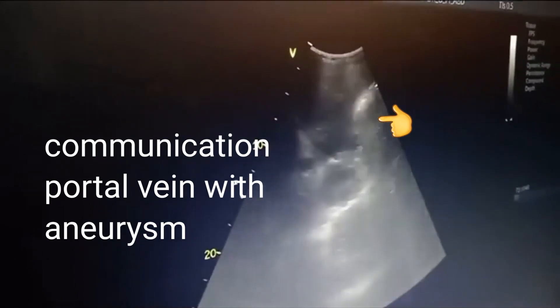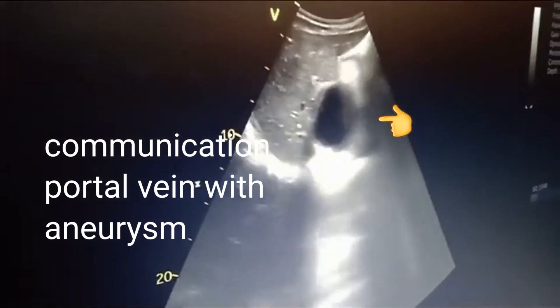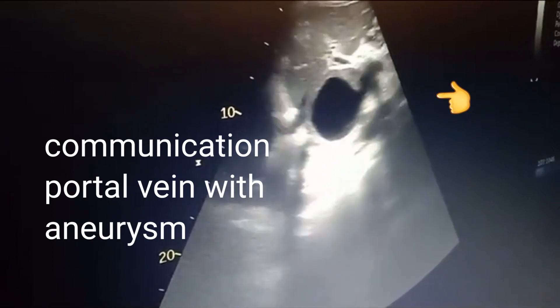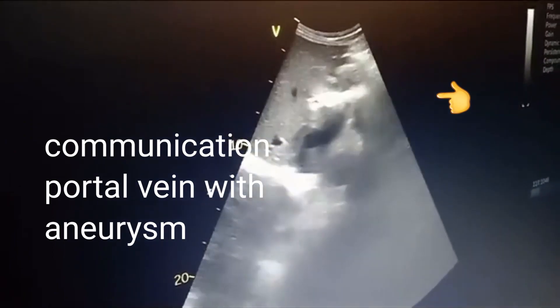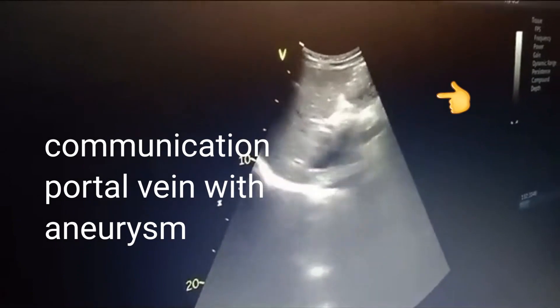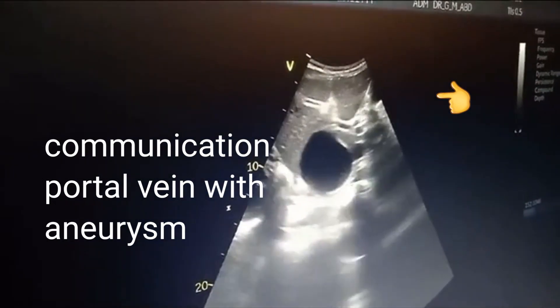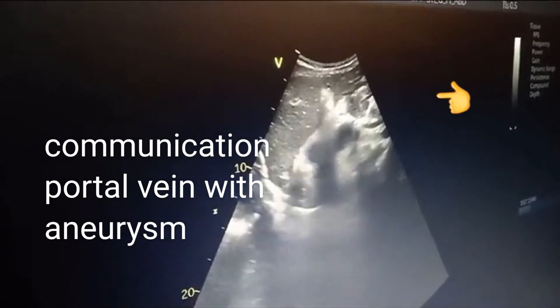So what are the important differential diagnoses? Conditions that mimic portal vein aneurysms include hepatic cyst, hepatic hemangioma, and localized focal nodular hyperplasia. A comprehensive evaluation including CT or MR imaging is necessary to differentiate these entities.